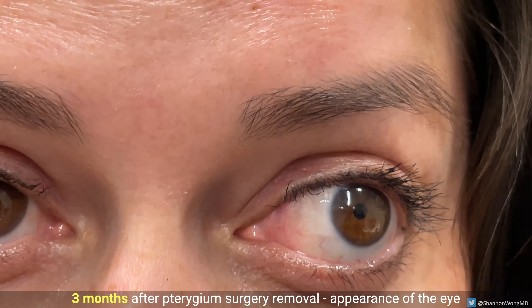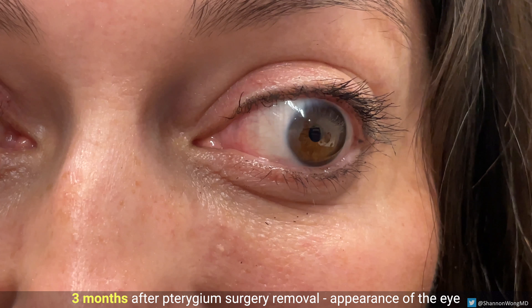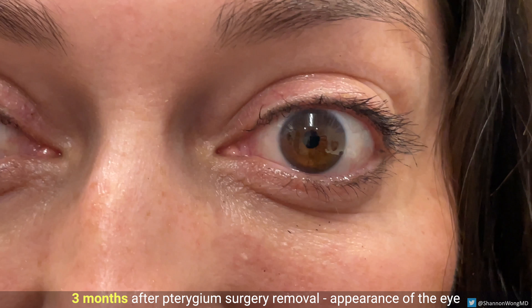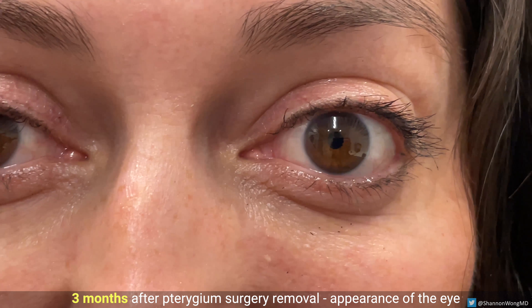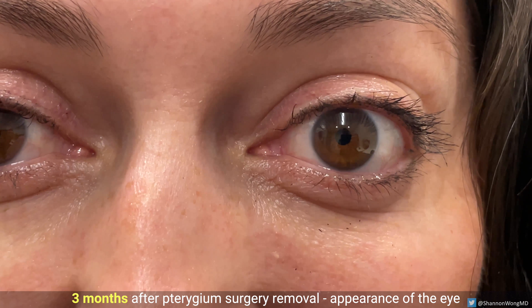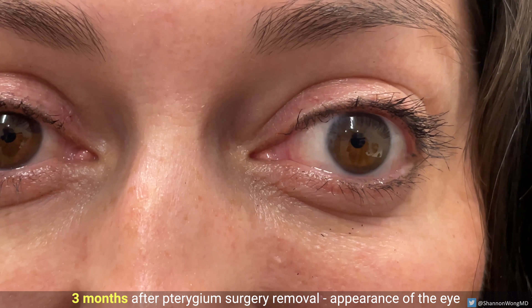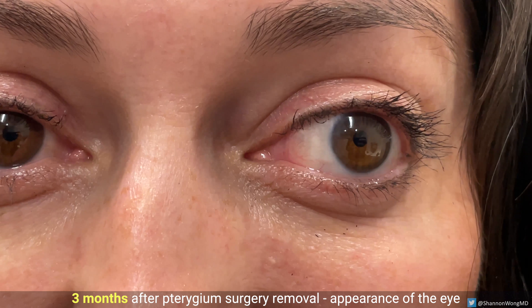I find the transformation from one day to three months after surgery to be gratifying for the patient and the surgeon. In general, using this technique for pterygium removal, there is a very low recurrence rate — probably less than five percent — and a very high patient satisfaction rate.